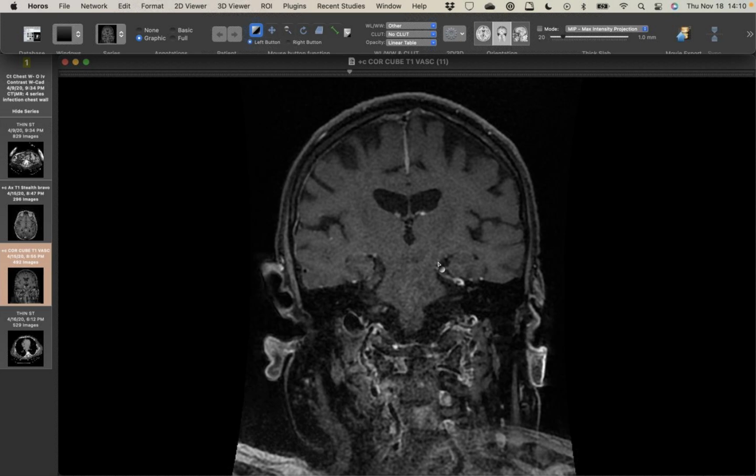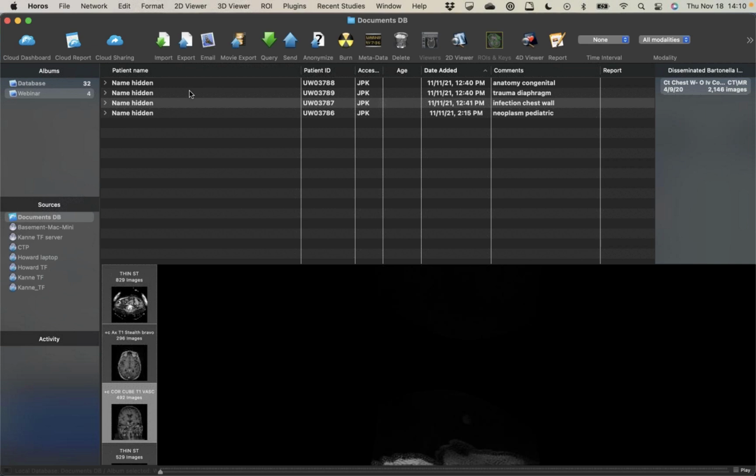But I had no idea it caused lytic bone lesions, but that was the only chest finding. I looked for the lung nodules, there weren't any, so nothing exciting. I thought you were gonna go sarcoid there. Yeah, that's a good one. PTLD was a thought given the spleen, but nope, it's Bartonella. The only case that I've ever seen.